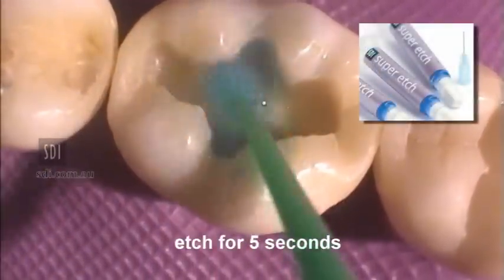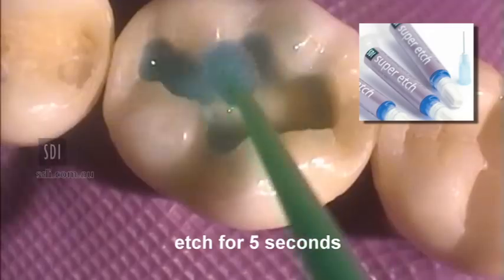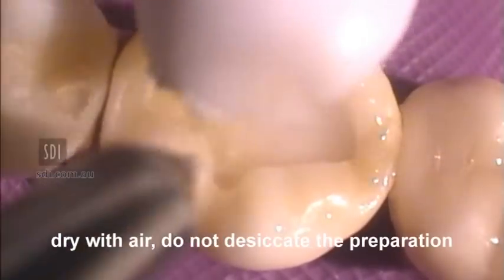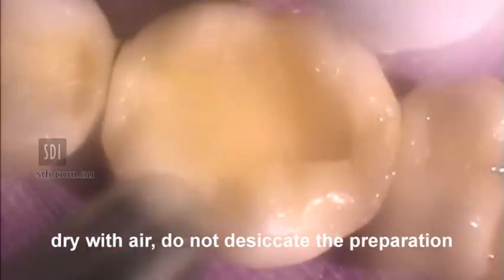Apply Super Etch 37% Phosphoric Acid for 5 seconds. Wash the preparation with copious amounts of water. Remove excess water with air, but do not desiccate the preparation.